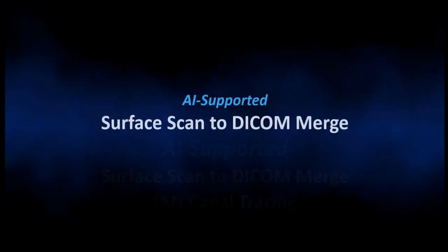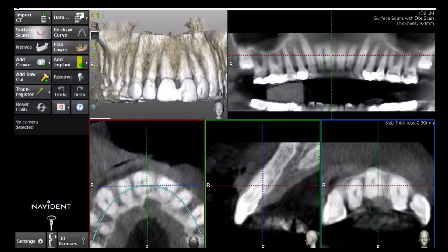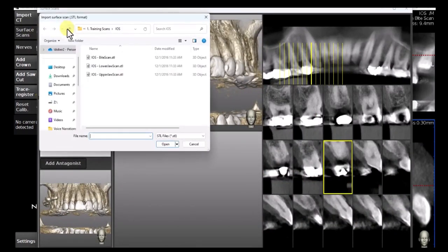Let's start with the automatic surface scan to DICOM merge. First, in the side panel, select Surface Scans. Then click on Import Surface Scan. Browse to the folder where the surface scan is stored, select it, and click Open.